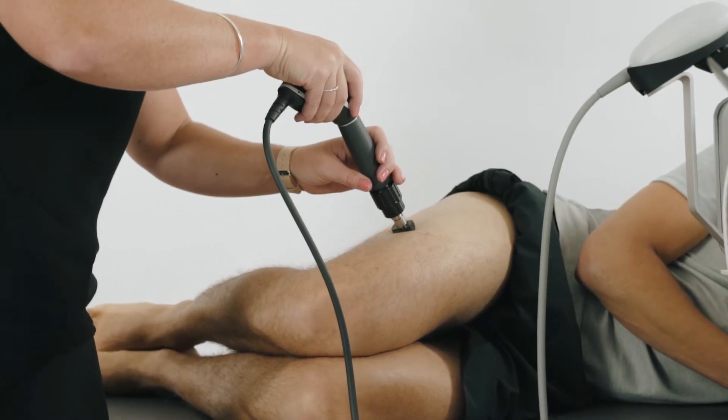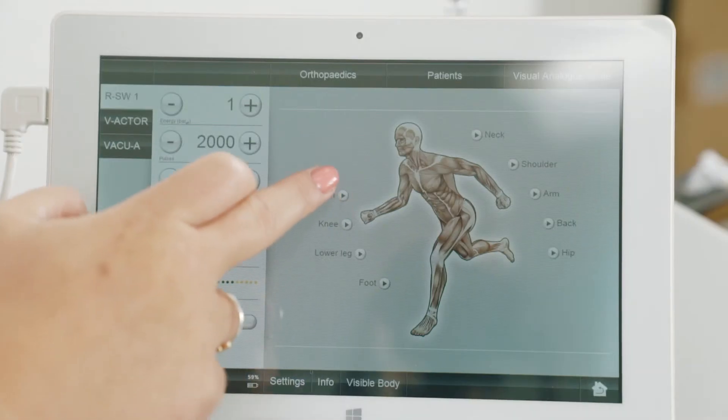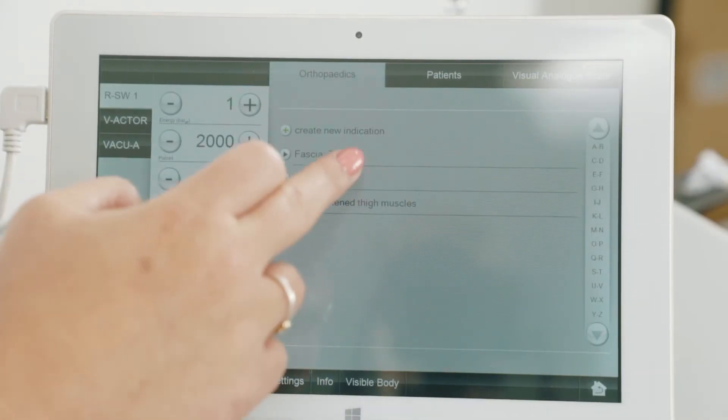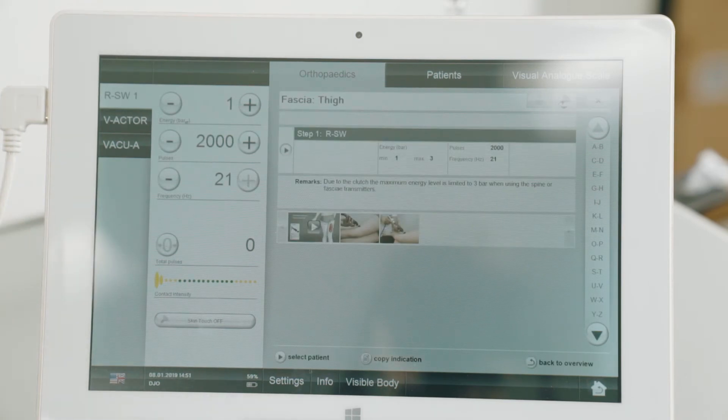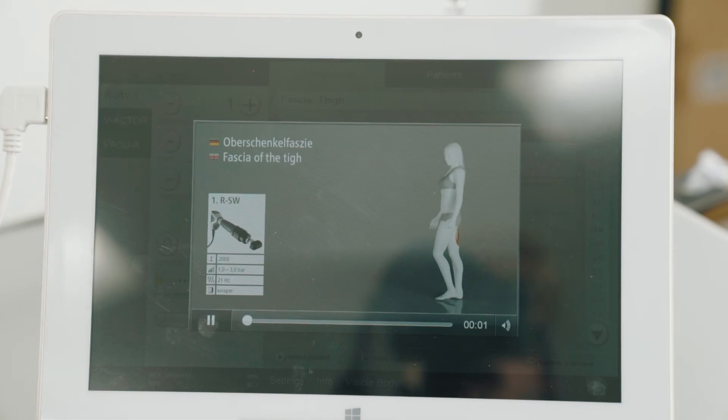To find the program for the fascia, in this instance we're going to work on the IT band and the side of the thigh. We're going to go to the thigh and you'll see here 'fascia thigh.' It's really nice and easy to use — it tells you there's a video there as well, and also a demonstration.